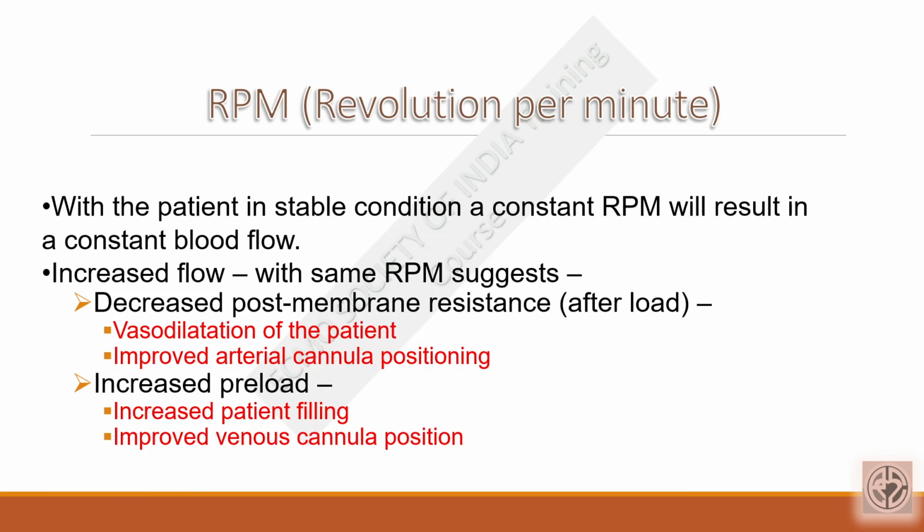Okay. And as I told you, what is important is the trend of the delta pressure, not one value, because different oxygenators have different delta pressures. With an RPM increase, your delta pressure is also going to increase to some extent. So what is important is the trend you have to observe. Suppose your delta pressure becomes more than 1.5 to 2 times. That means you have to think that the oxygenator is getting clogged. Okay, that you have to remember.